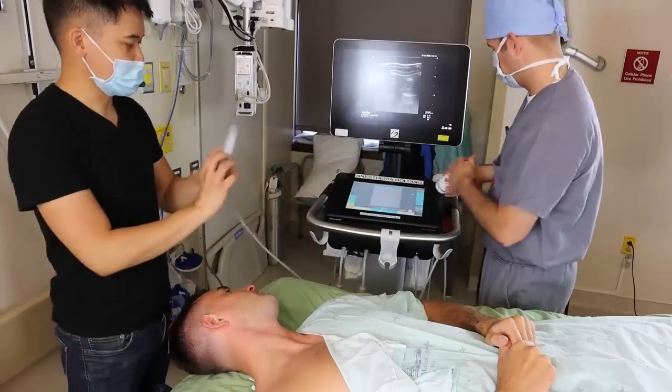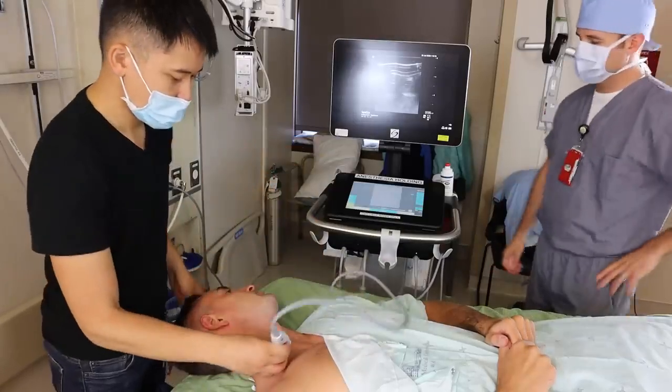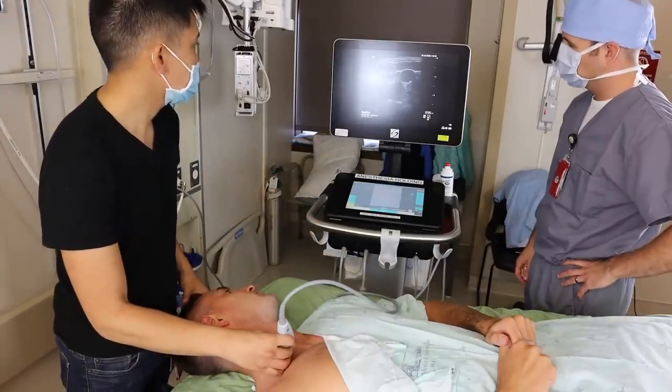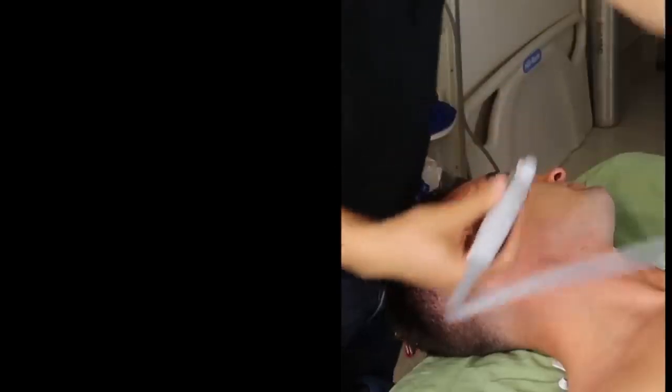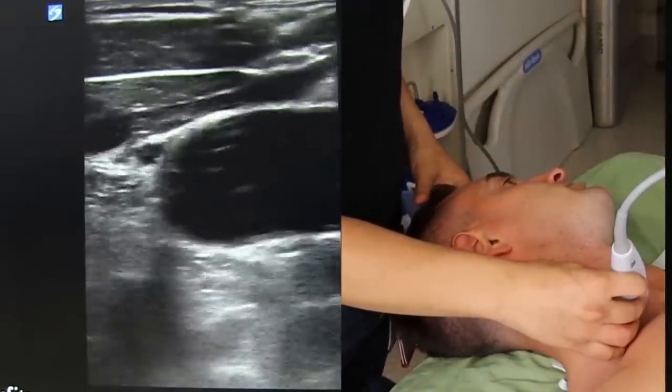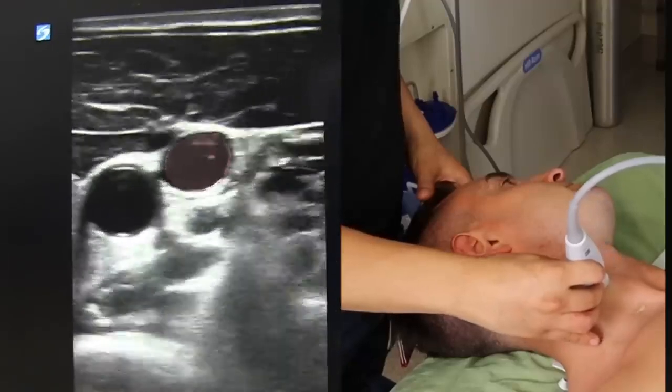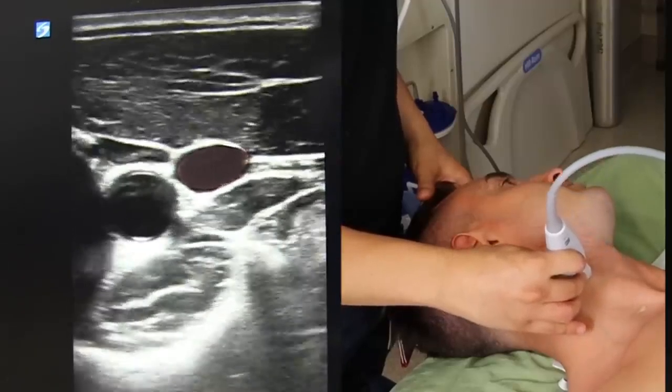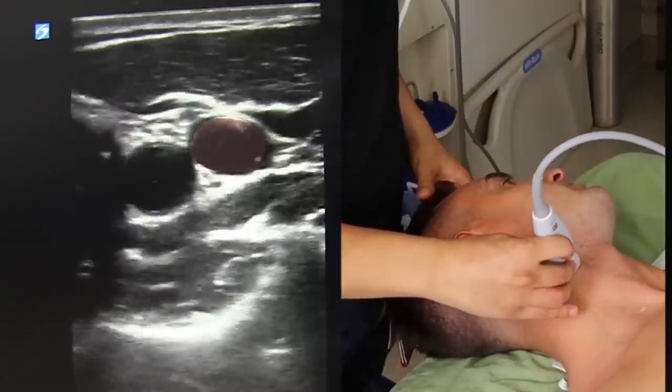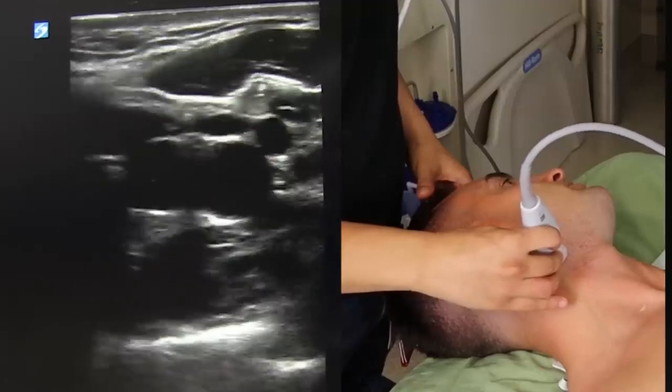Always look at the site under ultrasound before you drape to make sure it's suitable. This has saved me before from going after a vein that is thrombosed or has unfavorable anatomy. I start by tracing the jugular from as far inferior as I can and then up to the angle of the mandible so I can fully understand its course.